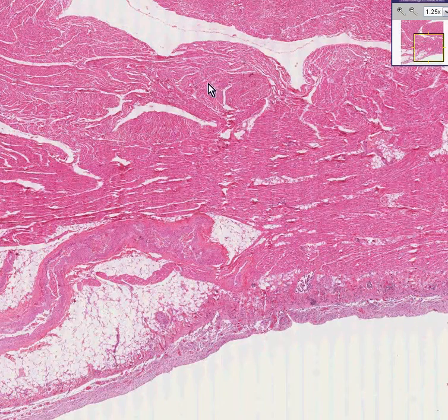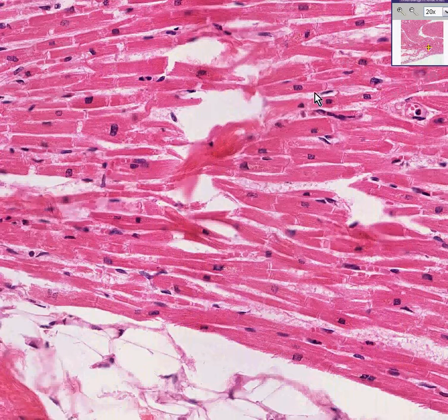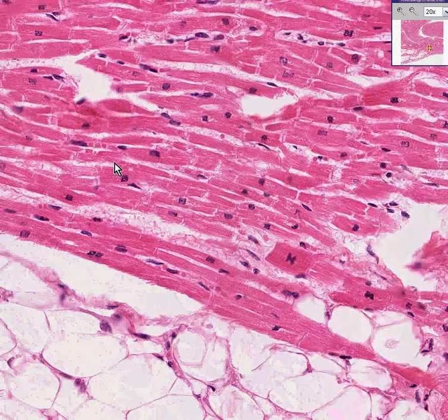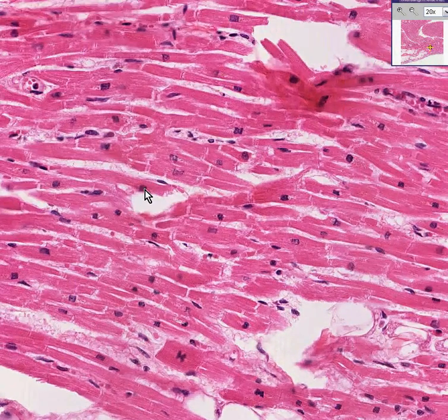You know this is a heart because it looks like myocardium. And to prove that, we will show you that we have cells with striations and intercalated discs in which the nuclei are centrally located and relatively square. This is all classic for cardiac striated muscle. Can we find better striations for you if you're not 100% convinced yet?